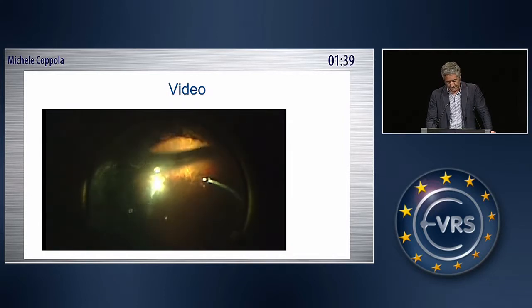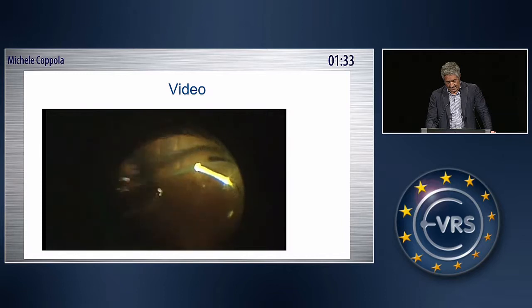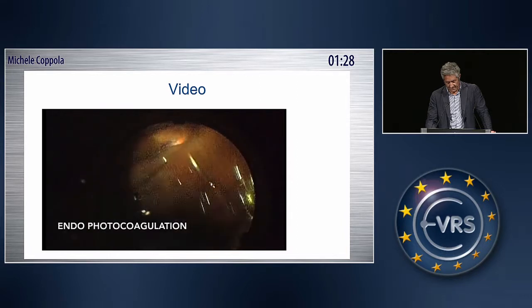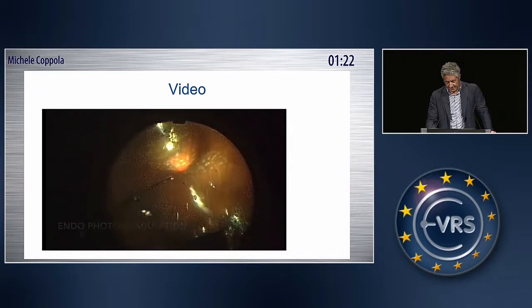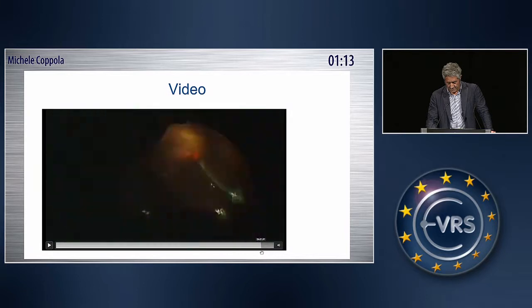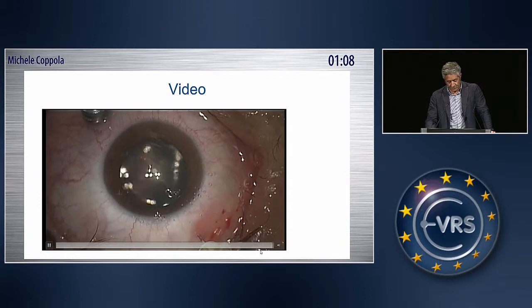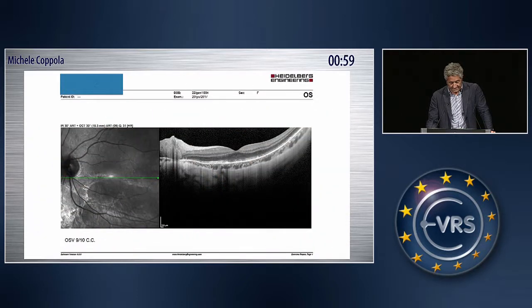It is a maneuver not easy to do, but you can do it. And particularly for this case, we paid a lot of attention to avoid touching the lens directly, and then did the photocoagulation around the primary lesion of the retina and a little bit also around it. Okay. We go to the end of the surgery, and the last maneuver is to inject some gas into the eye.